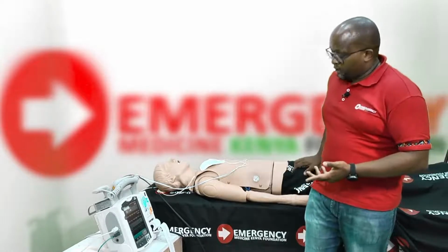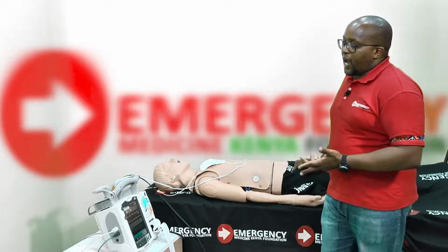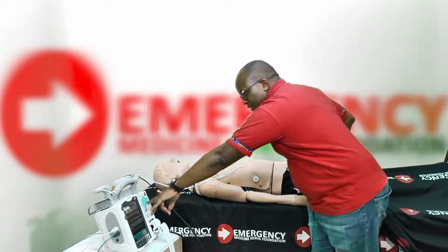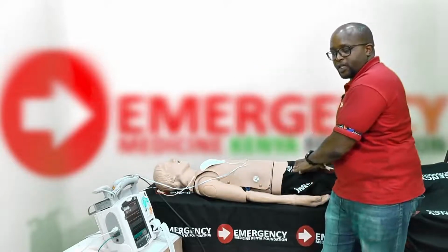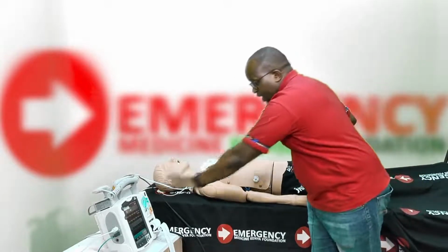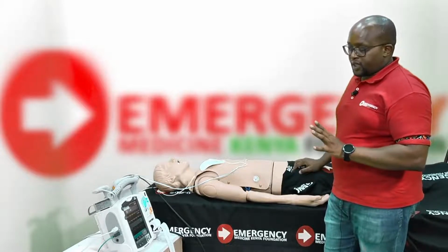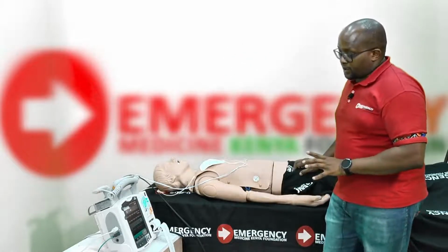So I'll check a femoral pulse. Normally I'll check the right femoral pulse, and I should feel the same pulse. If I'm seeing 70 here, I should feel 70 beats per minute on the femoral pulse. I see 70 there, I feel 70 here. All right, so that's mechanical capture. So I have electrical capture, I have mechanical capture.